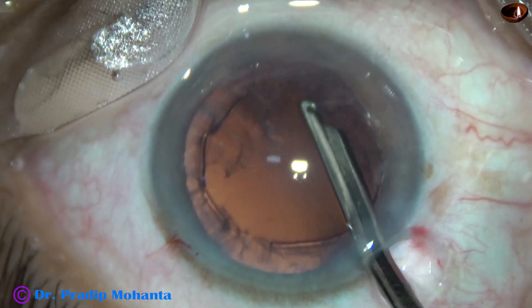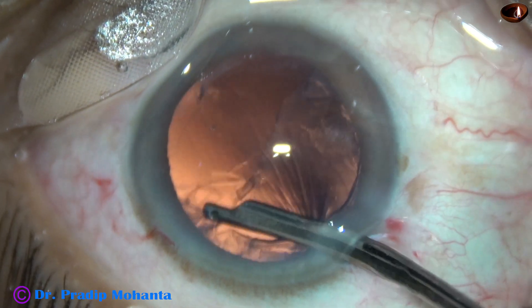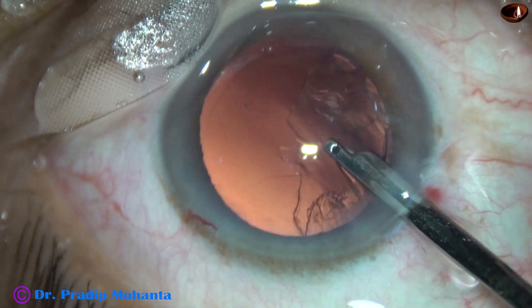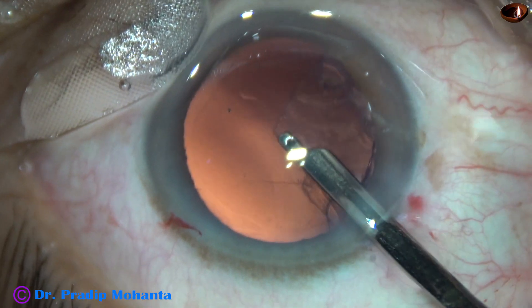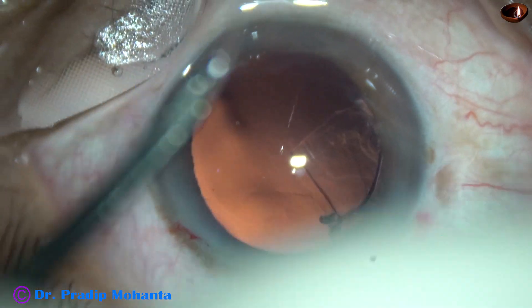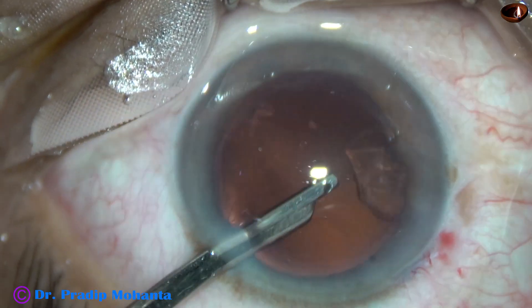Most of the cortex can be removed through the main incision. There is viscoelastic in the anterior chamber, so the anterior chamber is very nicely formed. Most of the cortex has come out. Now I go through the side port and remove the rest of the cortex, and it is done.